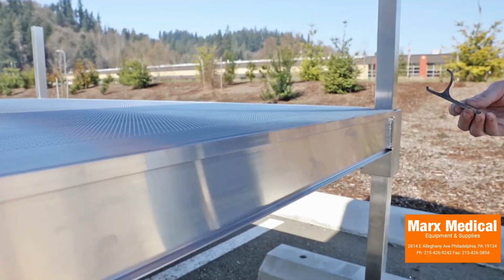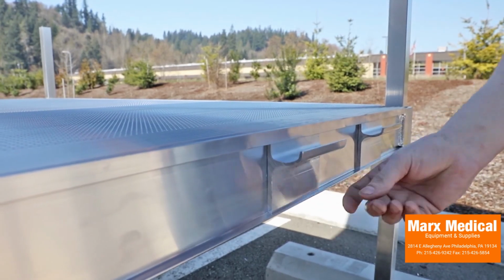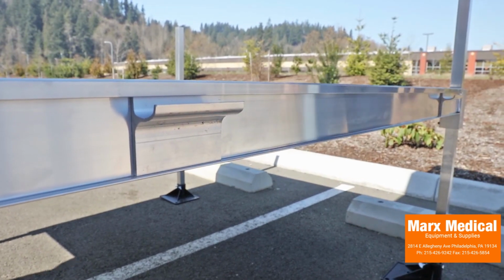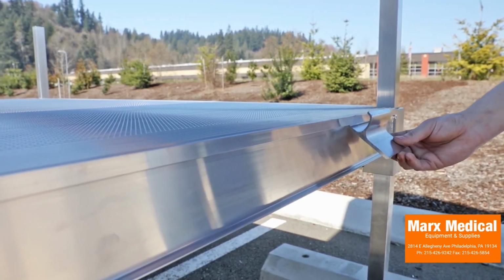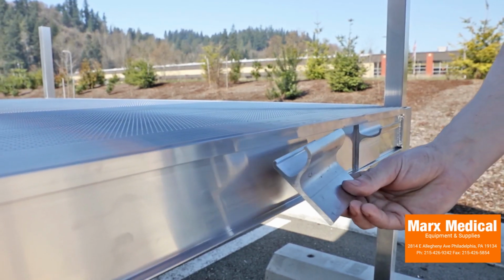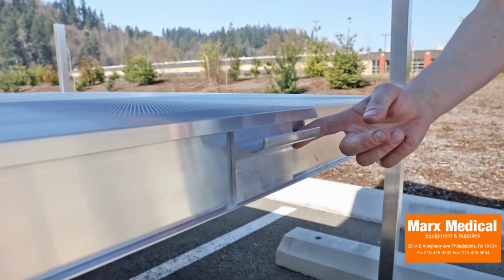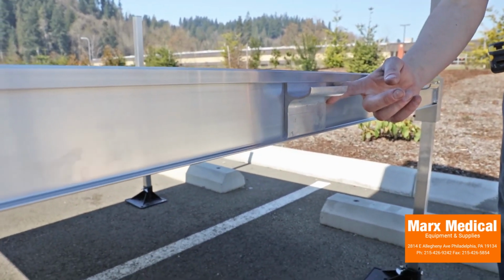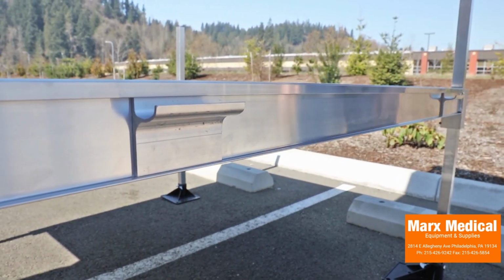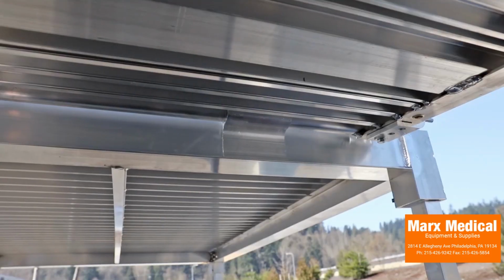Starting with the uppermost platform, install two ramp hangers in the platform side rail where the ramp will be attached. Hold the hanger perpendicular to the platform side rail, then bring the hanger upward until it's against the side rail lip. Rotate the hanger and continue pushing upward in such a manner that the hook at the top of the hanger goes behind and catches on the lip in the top of the platform side rail, and the hanger sits on the ledge at the bottom. Position hangers as close as possible to the outside of the ramp and set the ramp on the hangers.